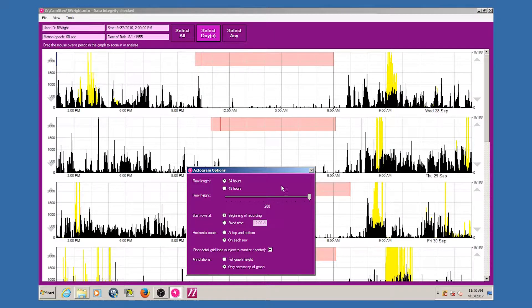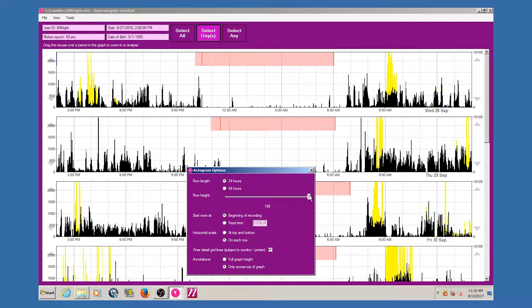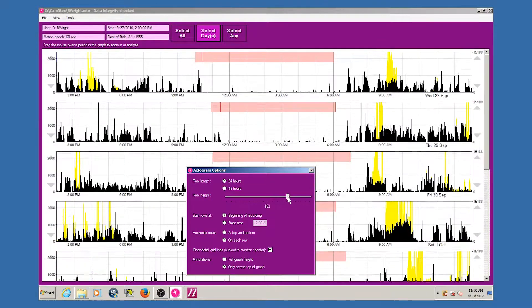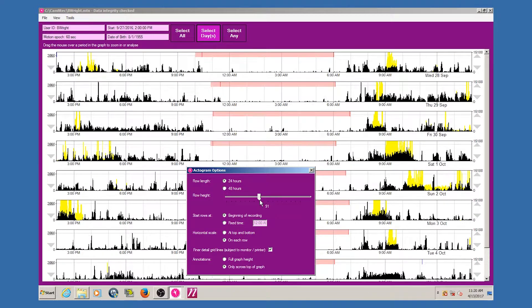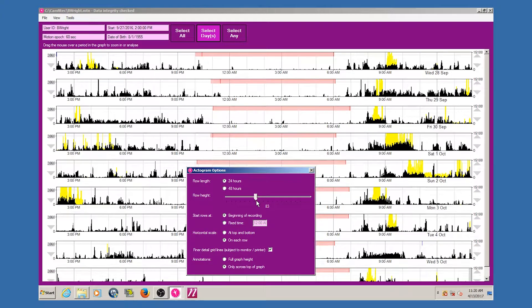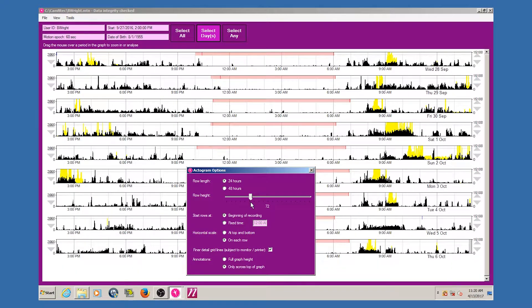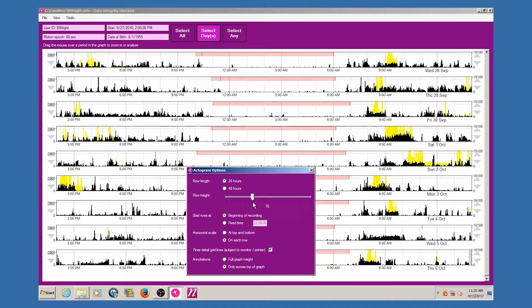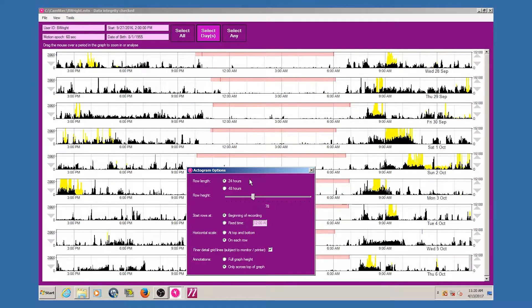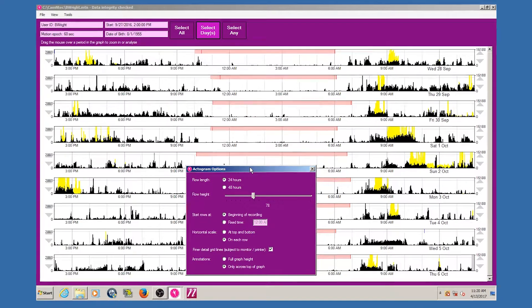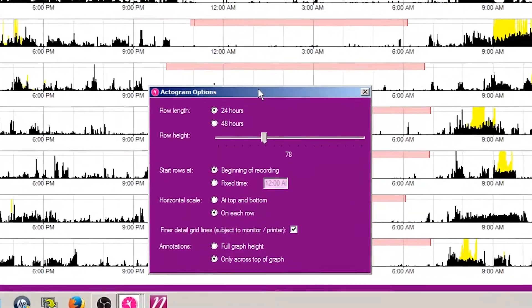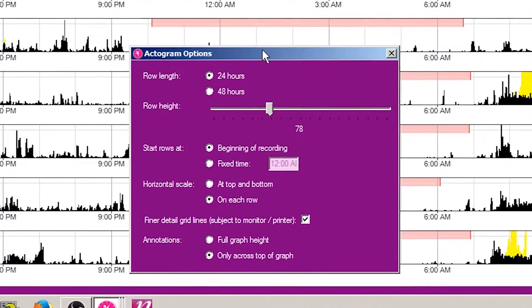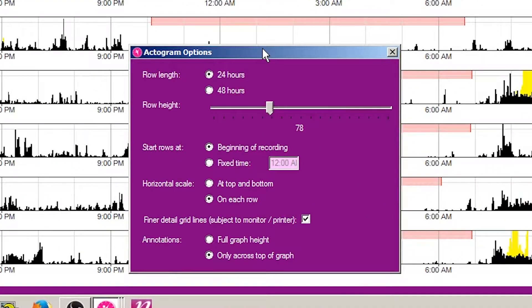Using the row height slider, you can adjust the height of each row of the actogram to show lots of detail on each graph, or vary compressed rows to present a longer time period on screen. Note that the range available here depends on the setting of the horizontal scale below.